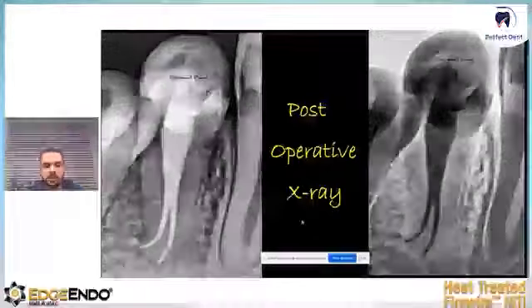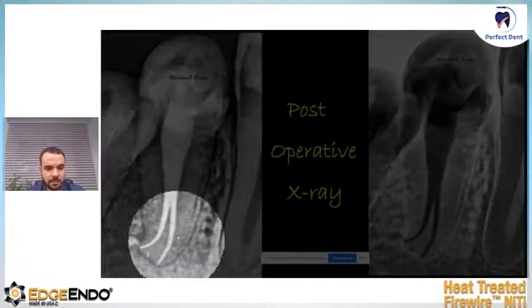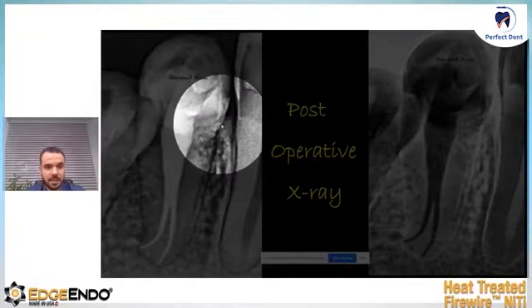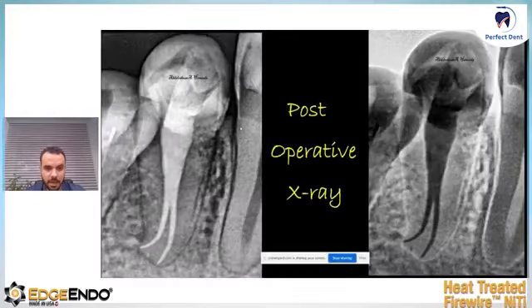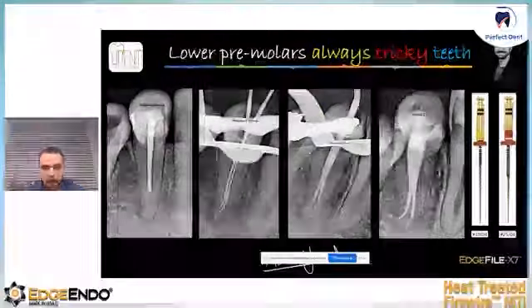After that, the post-operative X-ray shows minimally invasive canal shaping here and saving a lot of pericervical dentine, as we mentioned at the beginning. This is the full case.